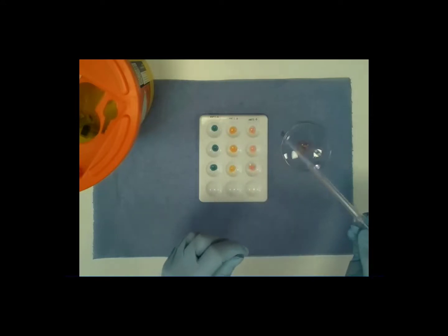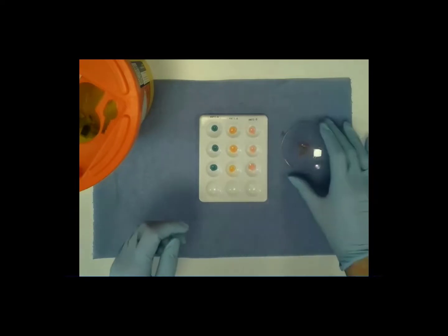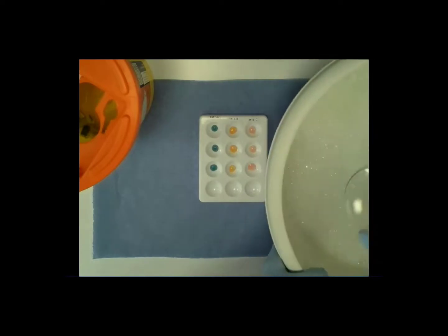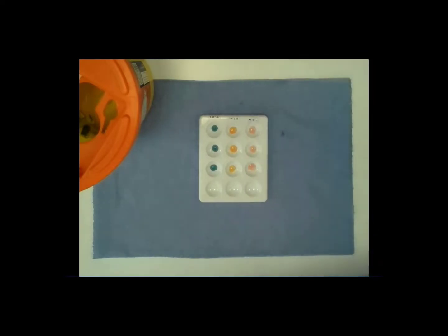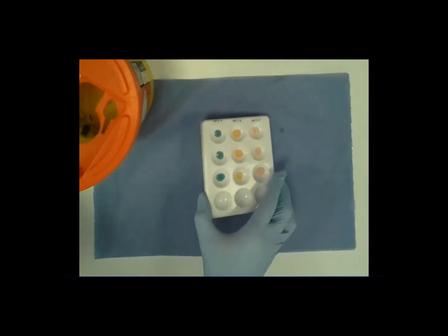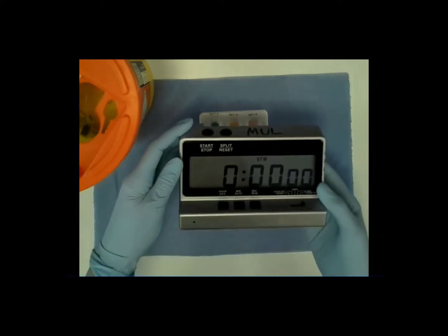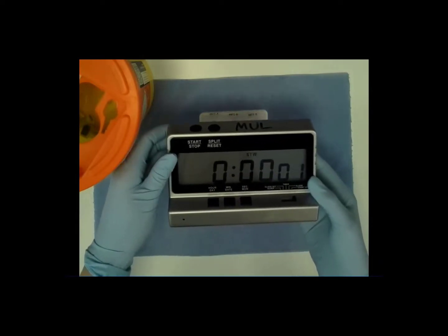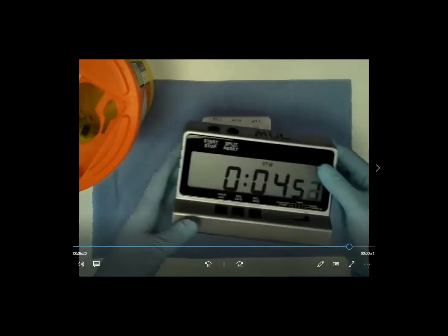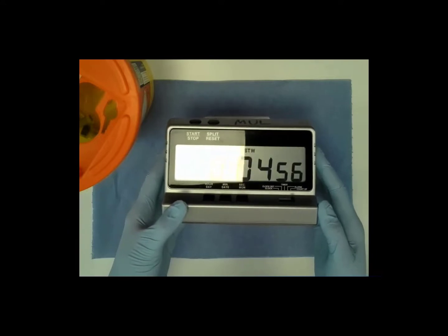The plastic pipette can be disposed of in the yellow clinical waste sack, and the glass watch glass again goes into the washing up bowl as these are reused. Carefully rock the plate to mix the blood with the antibodies and agitate the mixture. You then need to start the timer and wait for 5 minutes before you can look at the antibody. After 5 minutes, we need to take the plate and see if we can see any reactions.